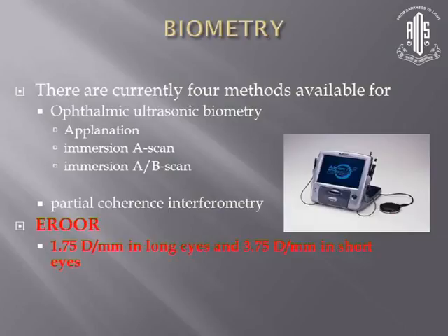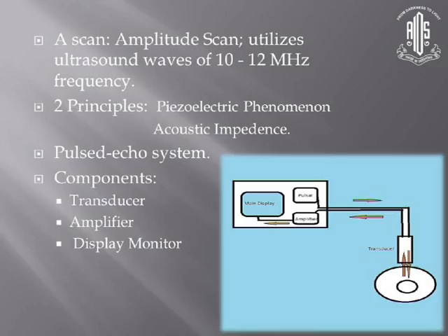Even with the best of surgeries, your final result will go haywire if you are not sure or if you are not correct in measuring the axial length. It basically uses ultrasonic energy and depends upon two different principles: the piezoelectric phenomenon and acoustic impedance.